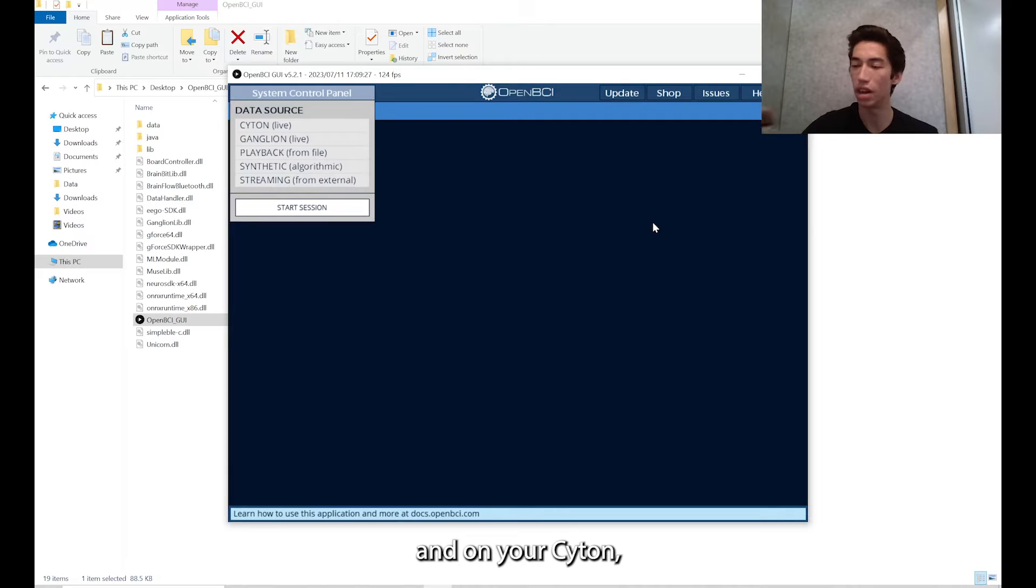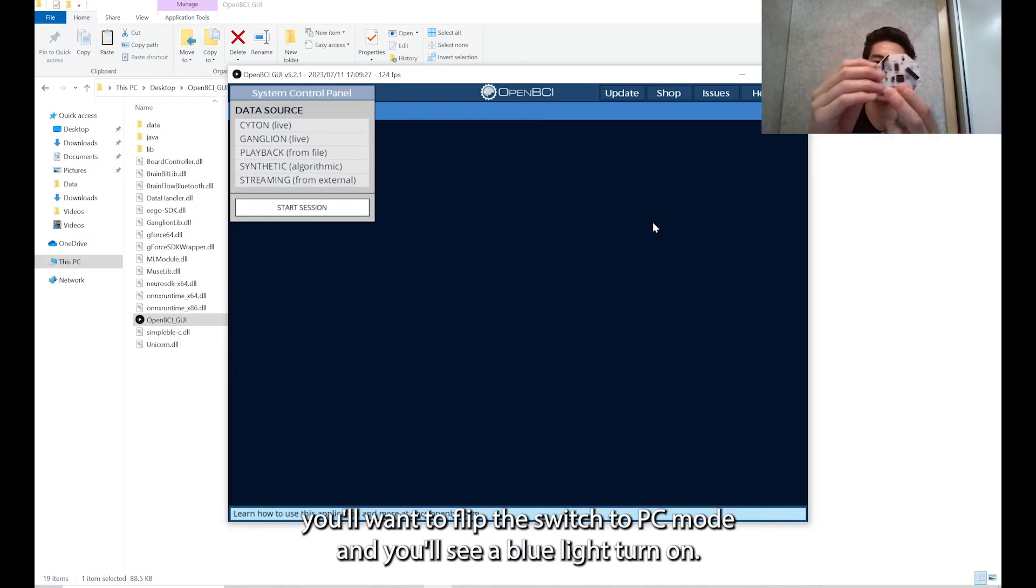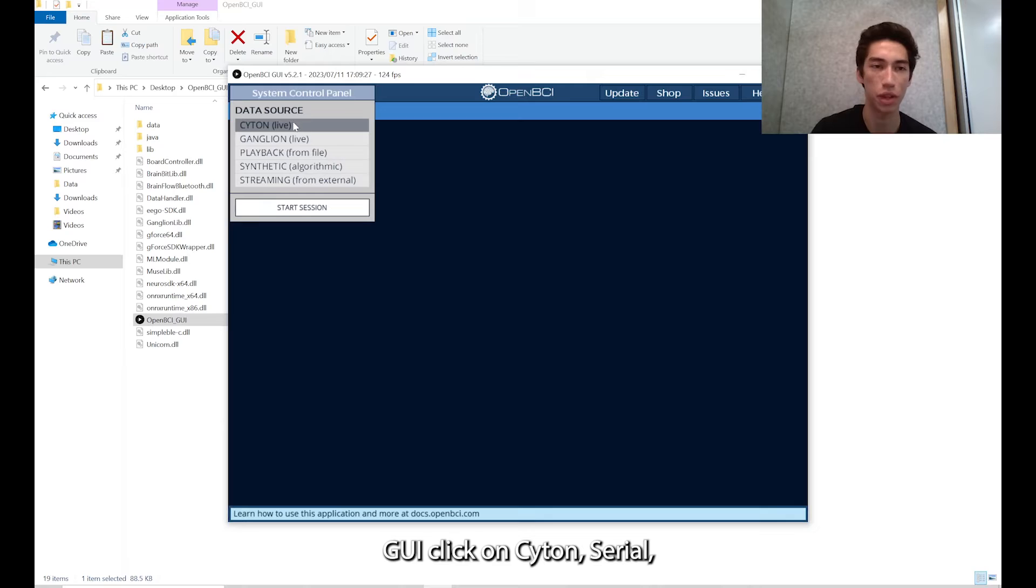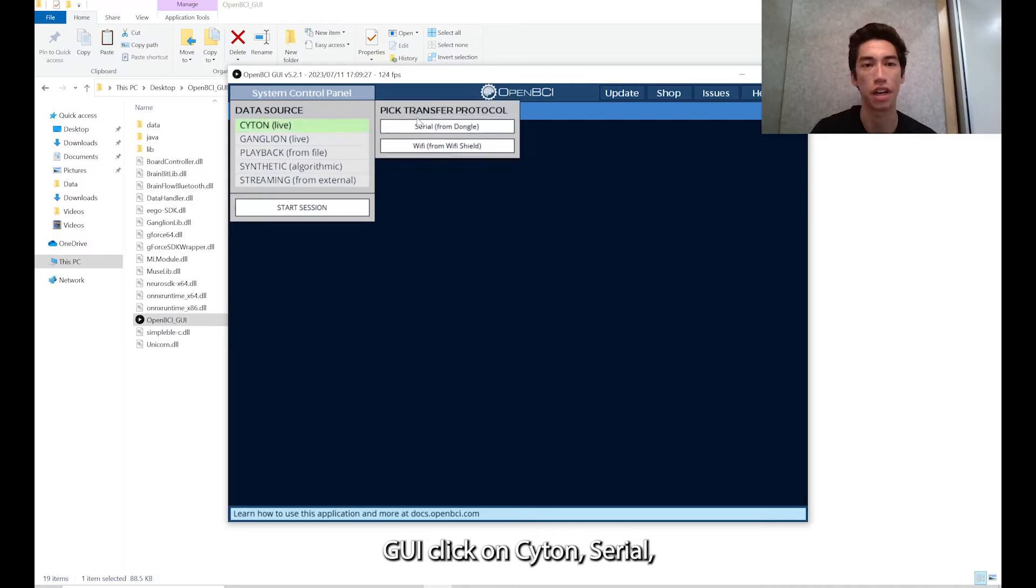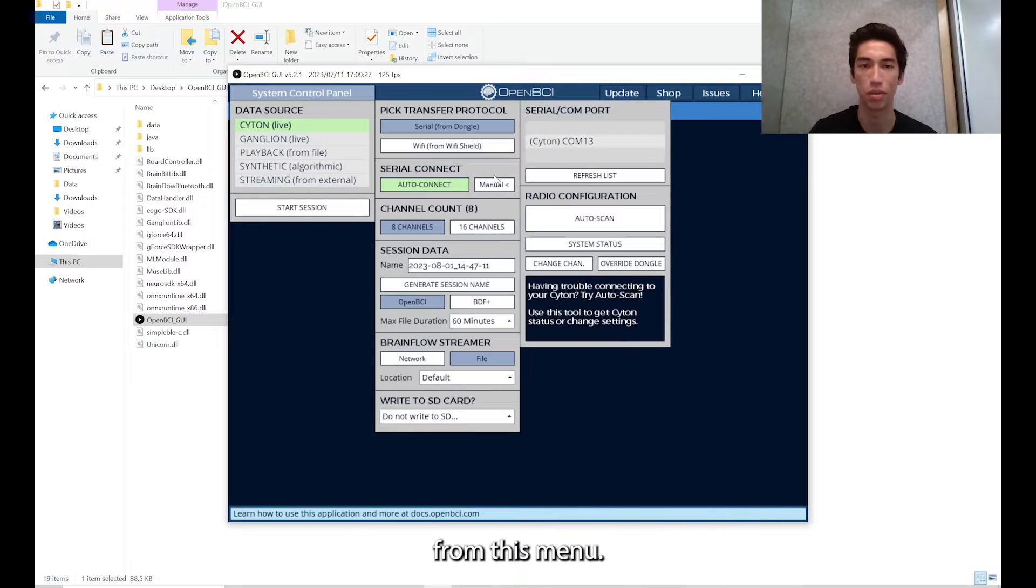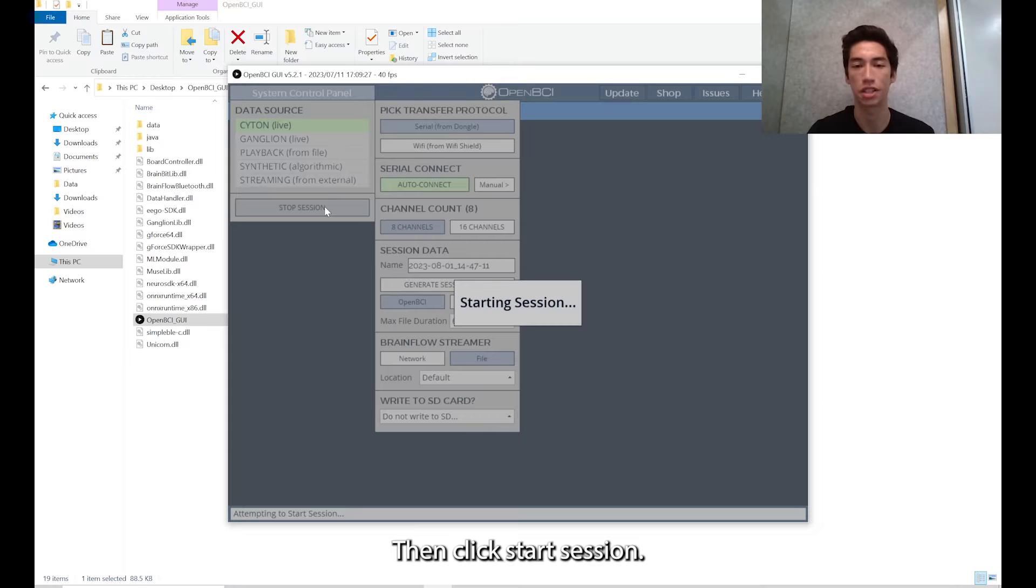On your Cyton, you'll want to flip the switch to PC mode and you'll see a blue light turn on. And then from the GUI, click on Cyton, Serial, and either use Auto Connect or you can manually choose from this menu. Then click start session.